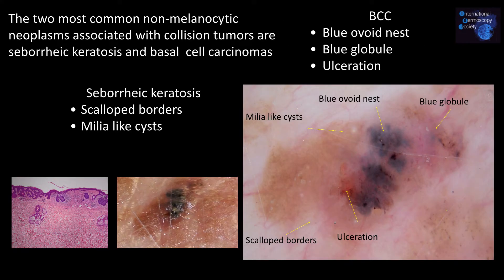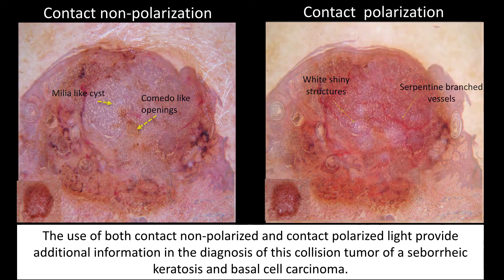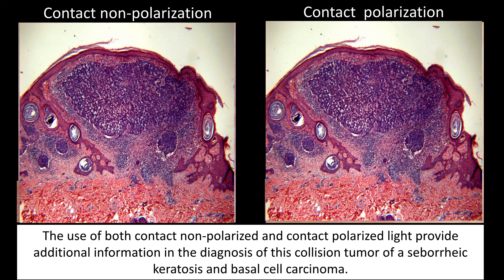The two most common non-melanocytic neoplasms associated with collision tumors are seborrheic keratosis and basal cell carcinomas. Here we see a neoplasm characterized by scalloped borders and milia-like cysts — the seborrheic keratosis — and blue ovoid nest, blue globules, and ulceration — the basal cell carcinoma. The use of both contact non-polarized and contact polarized light provided additional information in the diagnosis of this collision tumor, confirmed by histology.